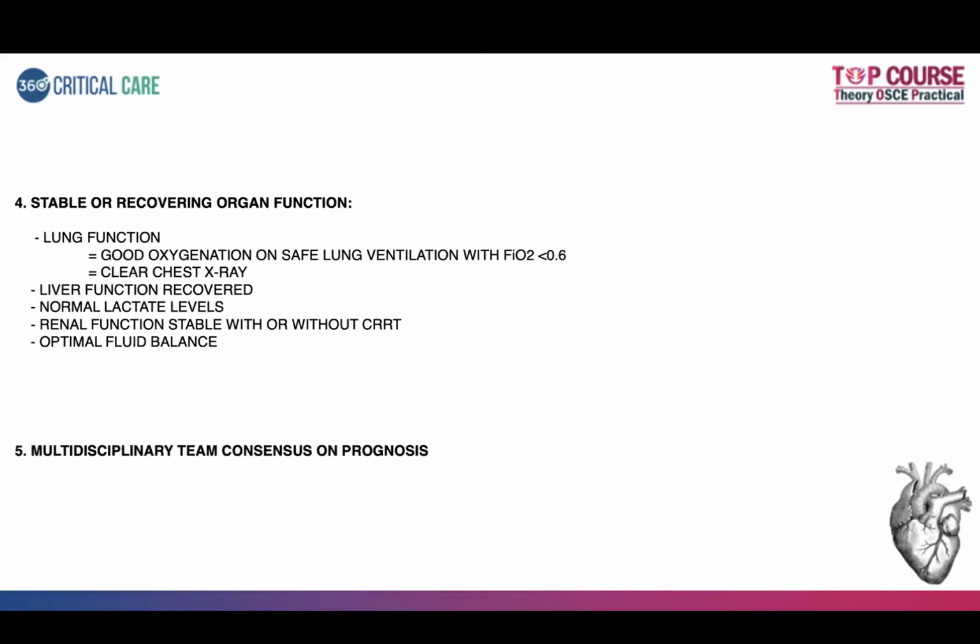And a multidisciplinary team consensus should be made on the prognosis. That is, the attenders should always be updated about the status. There can be further complications that occur even after decannulation, so that should always be informed to the patient's attenders. And during this whole process of ECMO, communication is a very, very important aspect that needs to be dealt with.